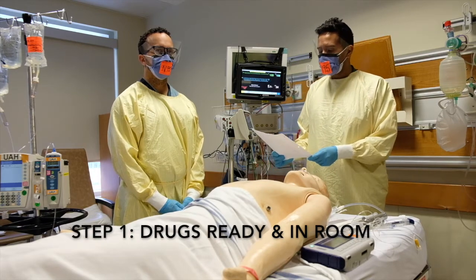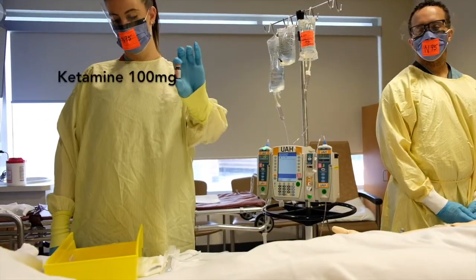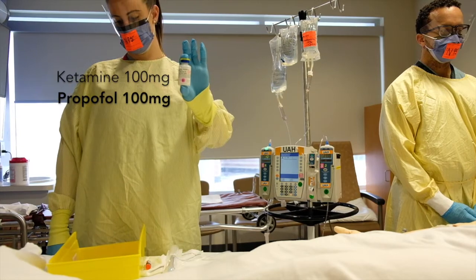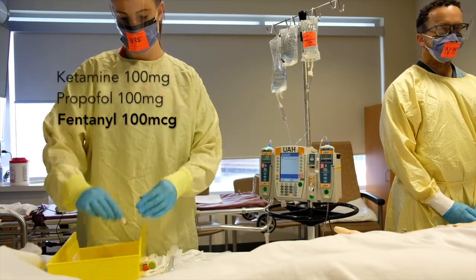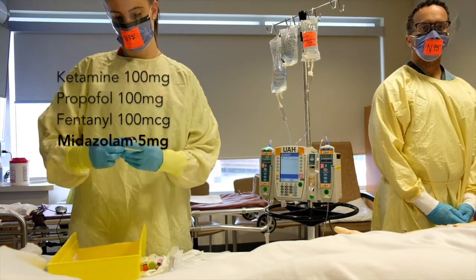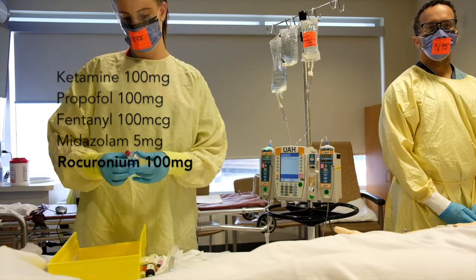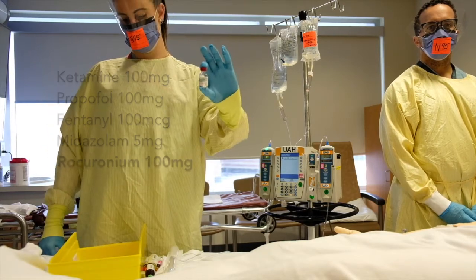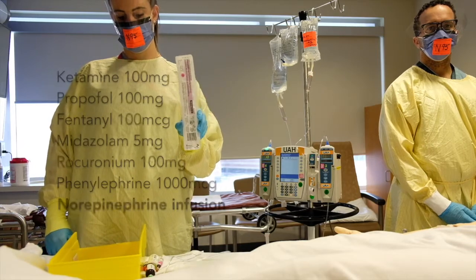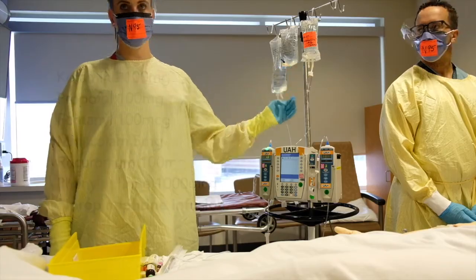So for drugs, do we have ketamine, 100 milligrams, propofol, 100 milligrams, fentanyl, 100 micrograms, midazolam, 5 milligrams, rocuronium, 100 milligrams, phenylephrine, 1,000 micrograms pre-filled, and norepinephrine ready for use.